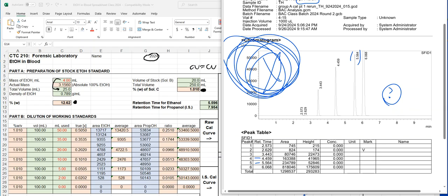All right, guys, so have fun. This is blood alcohol advanced level. It's probably more than what you needed, but at the same time, I think it gives you a nice flavor of how instrumentation is used in a forensics lab environment. A lot of times what our students and graduates would see would be this type of analysis.